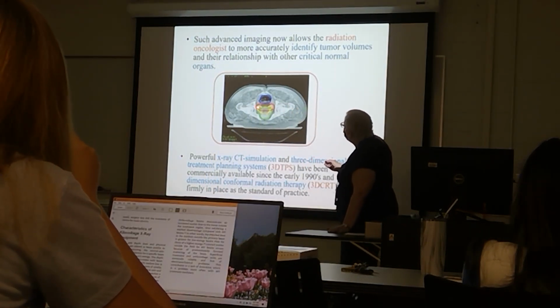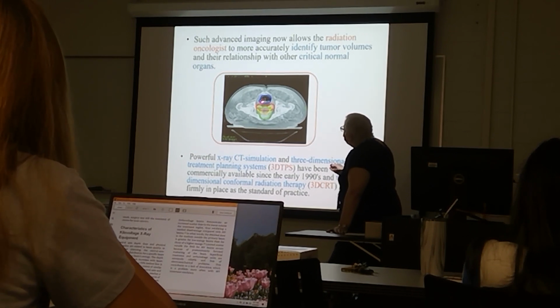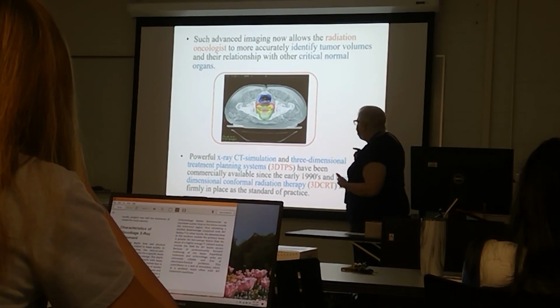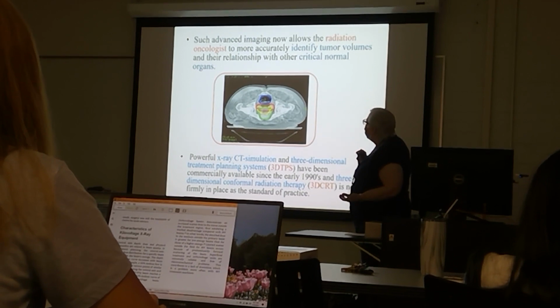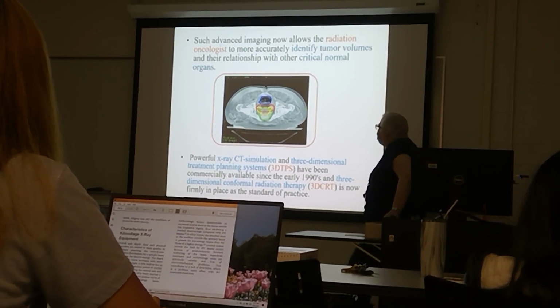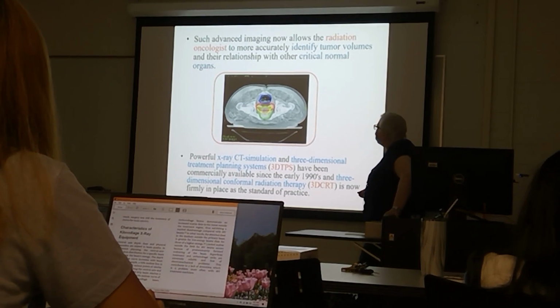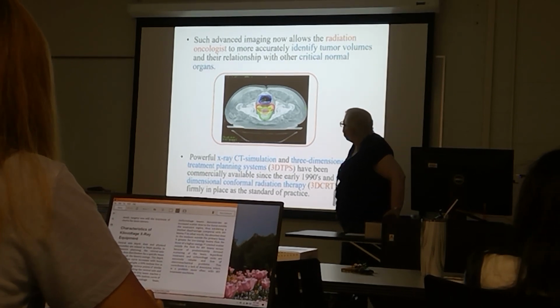So this, and this, and this, and this. So we'll say that we're treating the prostate. Tell me what color the prostate is on this picture. There's blue, red, yellow, and green.